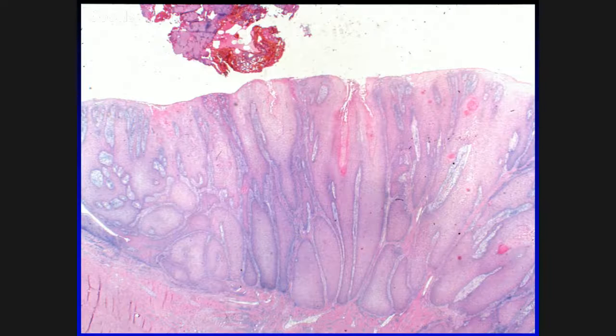Here's an example of that. The criteria applied to making a diagnosis of PVL as opposed to verrucous carcinoma is that if you draw a line, you can see the non-involved epithelium, and relatively there's no extension of this proliferation below that epithelium. You know, it can be very subjective.